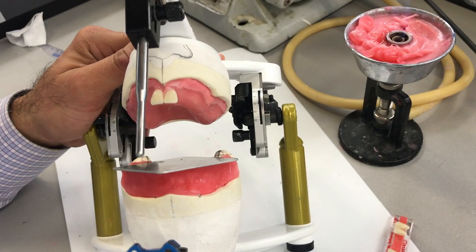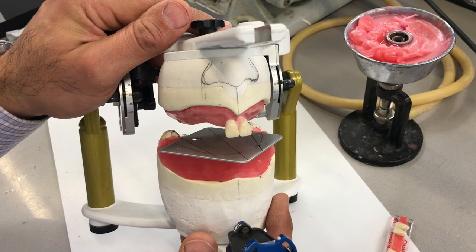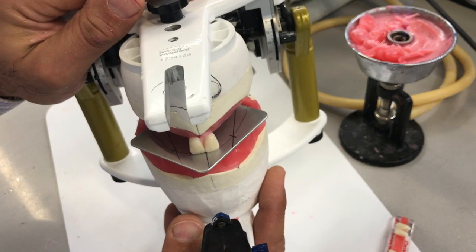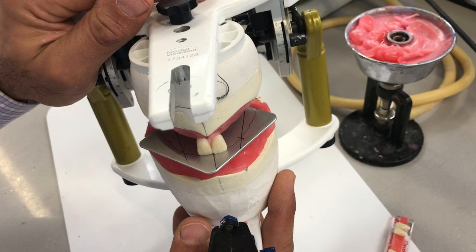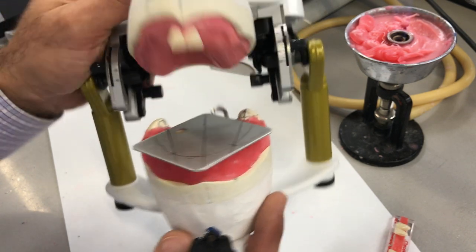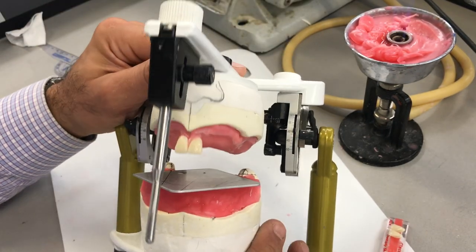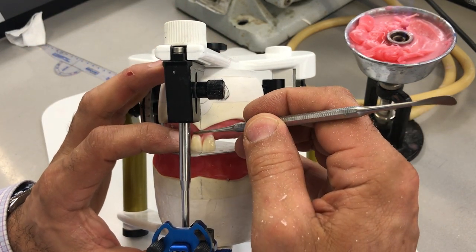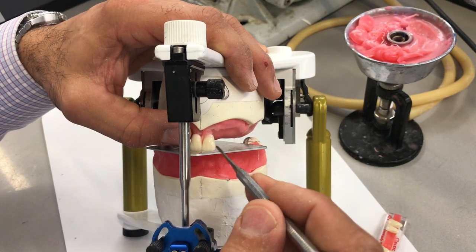Just for demonstration purposes, I'm going to remove the pin, but I'm going to be very gentle not to over-close this. Just for you to see that the mesial contact between 1-1 and 2-2 is sitting right over the midline. Don't take your pin off with warm wax underneath because it will collapse — and actually it did a little bit, so I'm going to have to go back and adjust that tooth.